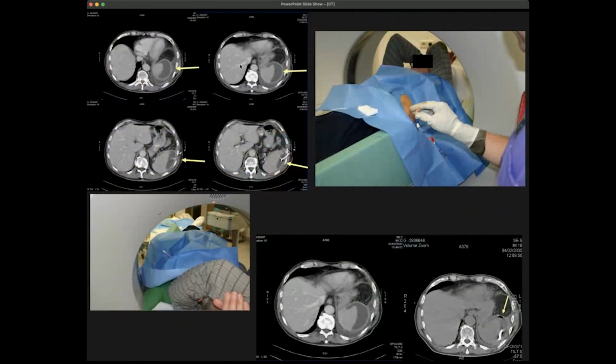And then what you can do is, you can see here, for example, a lesion with fluid. So what they do is they enter a needle there. You see the needle is very, very bright on the scanner because it's of course metal, and then they can drain the water out of it. So here you see before and after the draining of this.